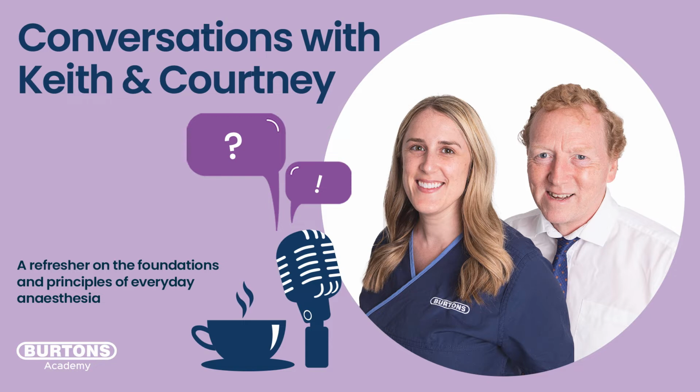So we're going to put some CO2 into the blood, or it's going to pick it up from the tissues. And the tendency would be, if that's retained, to alter the pH. So we're going to let some of that go when we get to the lungs, so we're not going to affect our blood pH too much. So we've got this great system of producing some CO2 and getting rid of it in a balanced fashion. And that's basically what capnography is about. We're looking to see whether our system is balanced. And if it is balanced, then we get the expected end-tidal CO2 value. So I think, does that give it a slightly different slant?